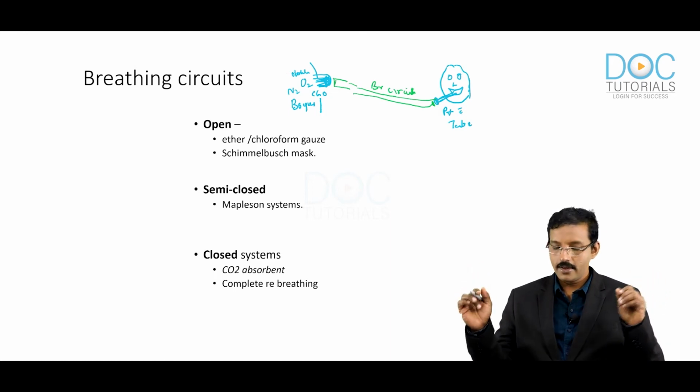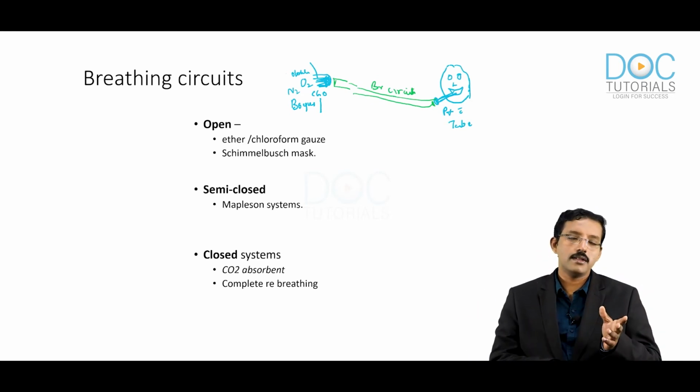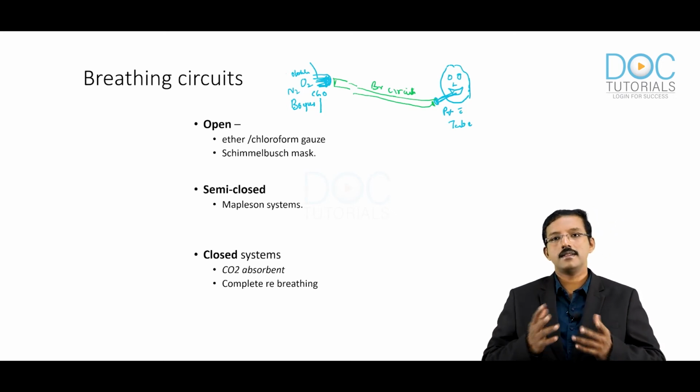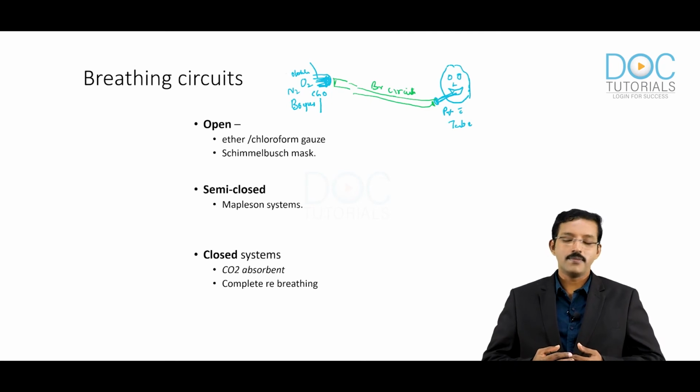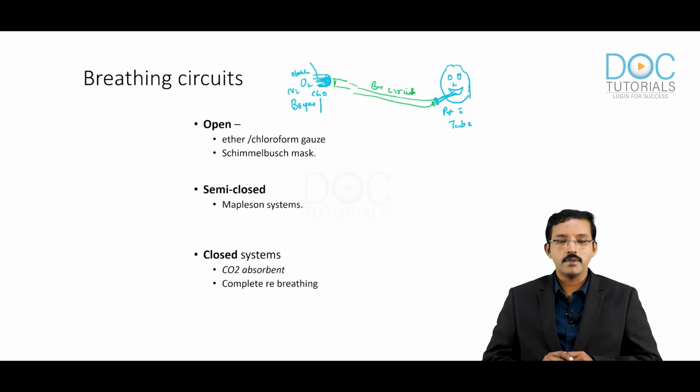tube of the patient. Now common breathing circuit has been classified into different names and different groups, and finally it has evoked a lot of confusions. So finally now we have managed to classify it in a little more acceptable manner, easy to remember. So we will put it in three classifications. One as open circuit, and the second is closed circuit, and something in between as semi-open and semi-closed. Both semi-open and semi-closed can be considered as a same modality or a same circuit.